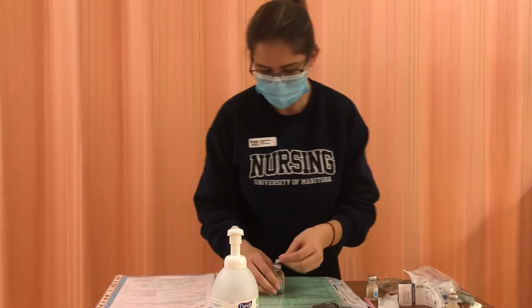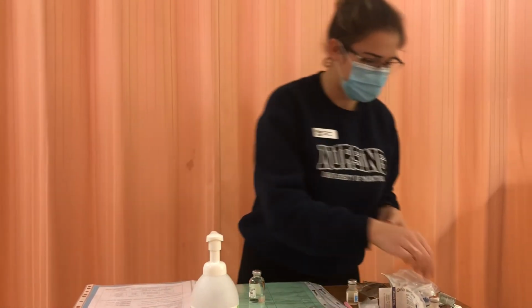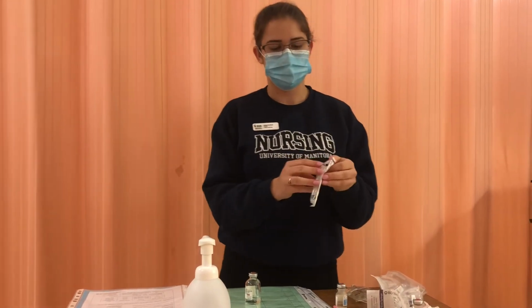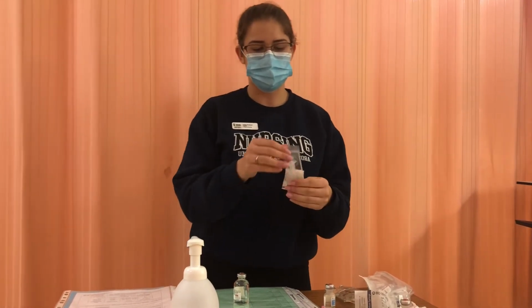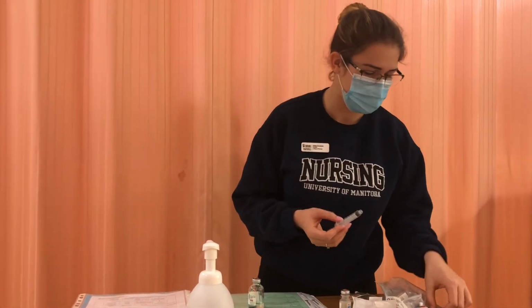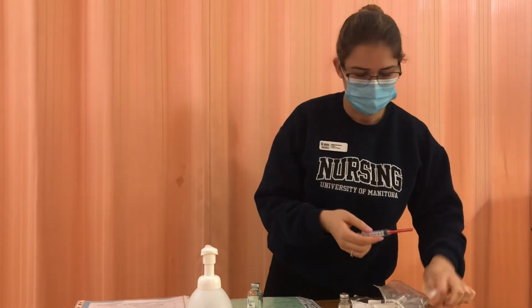So I'm going to use a new swab because I probably touched it to clean it. So I'm going to clean for 30 seconds. Okay, so 30 seconds has passed. So now I'm going to grab a new 5 ml syringe to draw up the dose because the dose is 3 mLs and I want to get as close to the amount as possible. Like I'm using a smaller syringe rather than the 10 ml syringe because it's only 3 mLs and I want to be as accurate as possible.